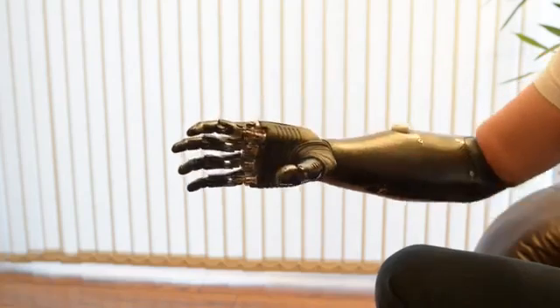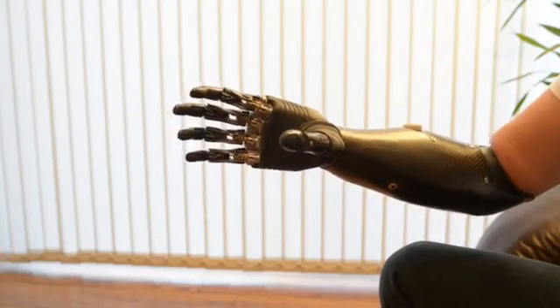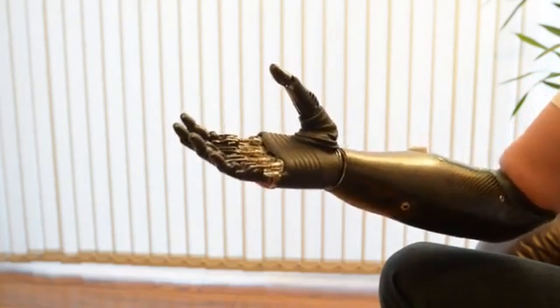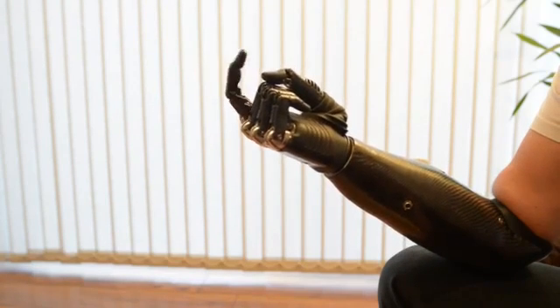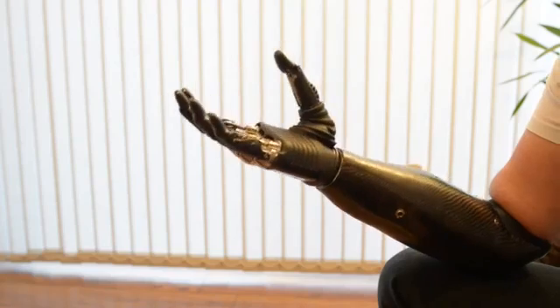Then we have this grip here. This is one that scares children and upsets my wife. I'll rotate the hand here. This is trigger grip, but it can be adapted if you so wish — if you've got the guts.